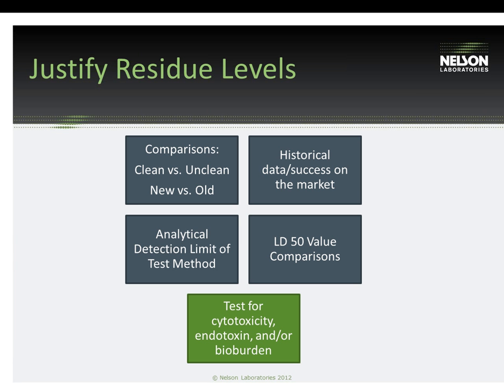And so these dirty to clean comparisons are often what we see to help show that residue on the cleans is clean. We also see people comparing new versus old processes, and this is probably most prevalent when we're seeing people who have maybe implemented a change in their process like we discussed before, and they're trying to show equivalency between the two processes. And so these comparisons can help show, after you've established your criteria, if those changes were beneficial to implement or not.